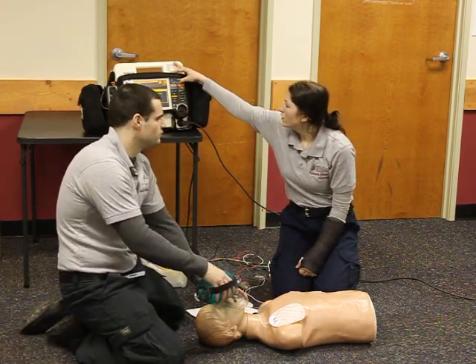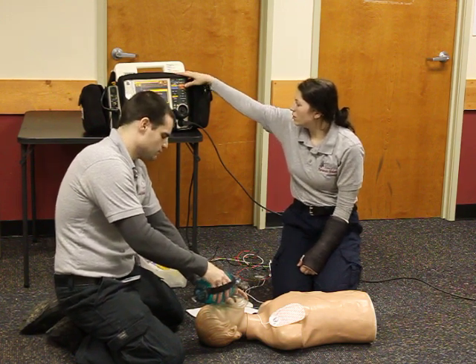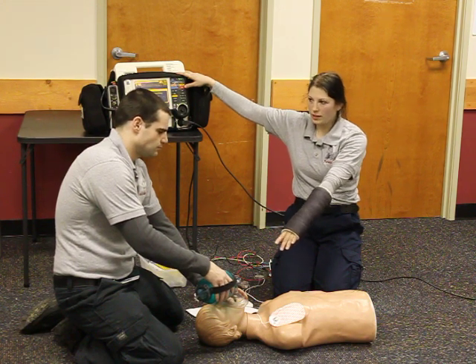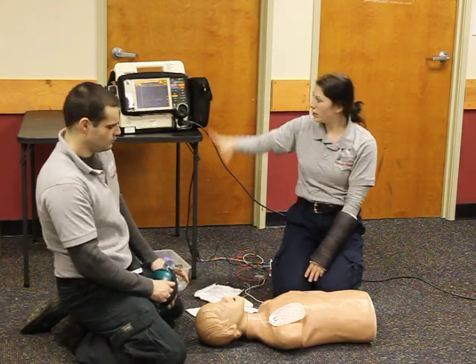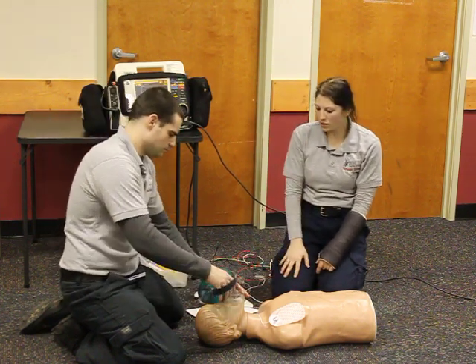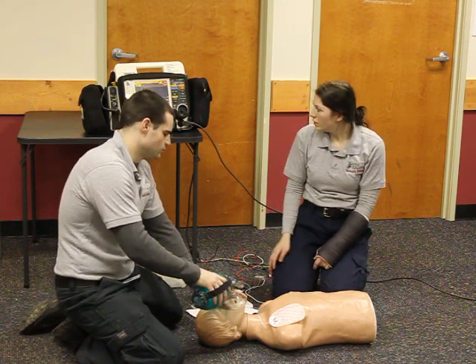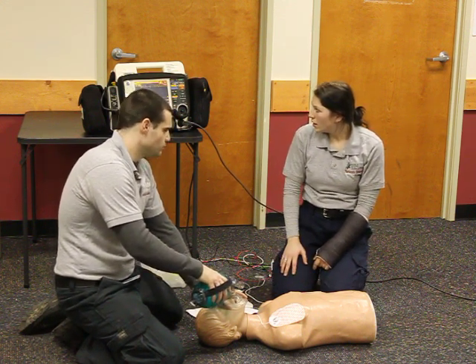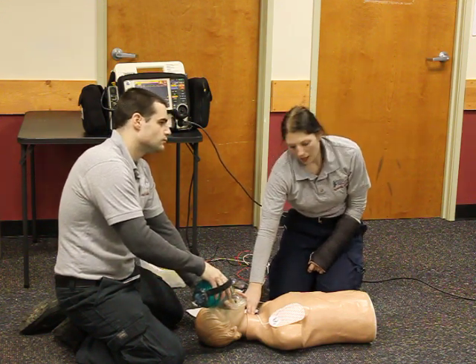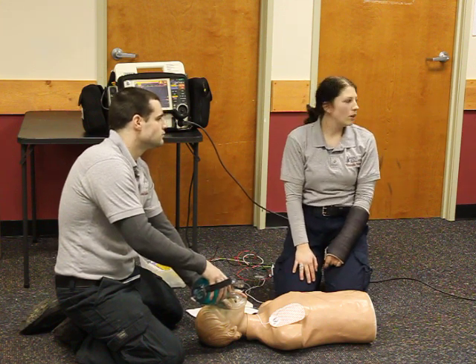Select 50 joules to start. Charge it, and once it's ready, I'm going to clear the patient. Clear the patient. I'm clear, you're clear, everybody is clear. Shock. We're going to continue ventilations. Going to recheck the monitor. I note a normal sinus rhythm. Does my patient have a pulse? No pulse. He is now in pulseless electrical activity, or PEA, with an underlying normal sinus rhythm.